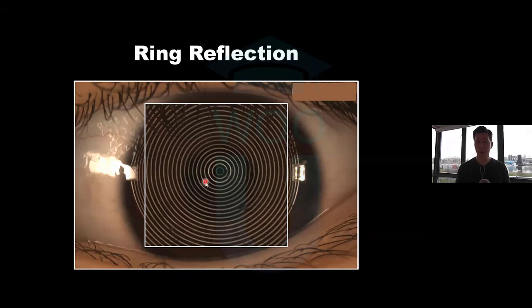So if you have tear film breakup near the center or within the central 10 or 15 rings, that potentially could create a very erroneous topography and send you down the wrong path. So I can't emphasize this enough, how important quality baseline topography is.